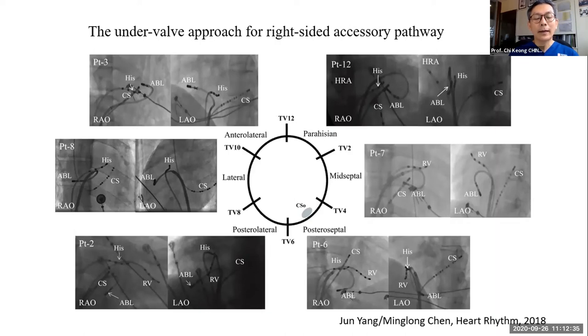That would be useful, and to look for sudden bursts of bubbles. That is a warning for impending steam pop. So if you notice irrigation just goes through like a storm, you have to stop ablation, that may prevent a steam pop.